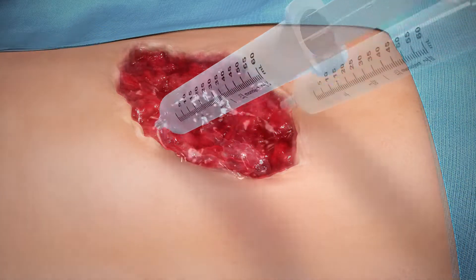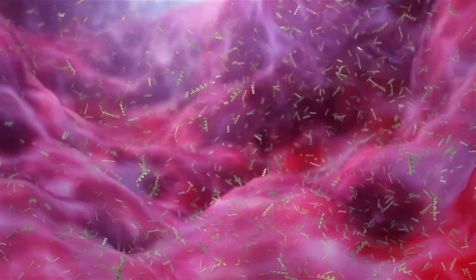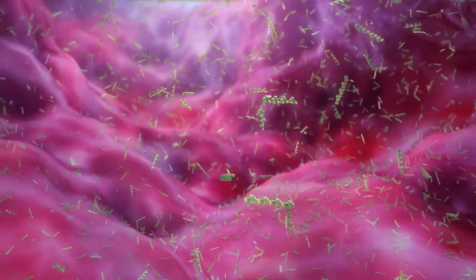AC5 Advanced Wound System contains specially synthesized biocompatible and resorbable peptide strands that flow freely into the wound and its irregular edges.